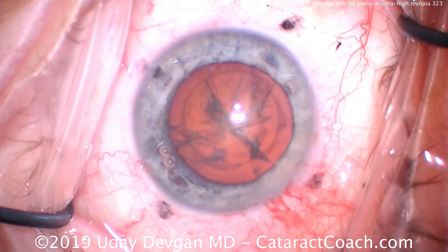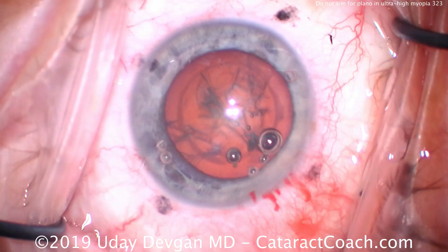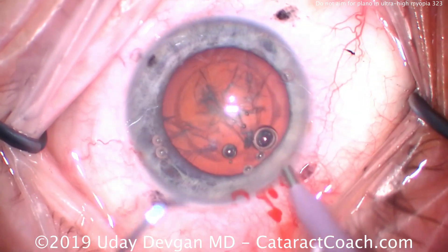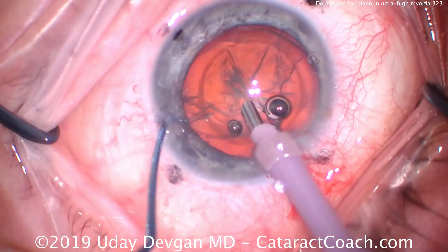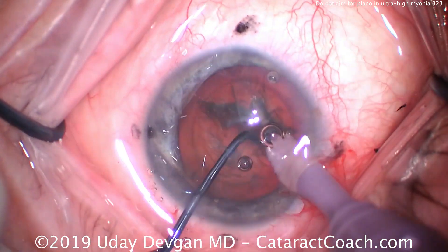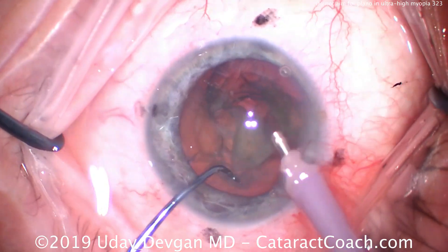The lens nucleus is hydrodissected then rotated. There's the rhexis — it looks very nice. A little extra viscoelastic to protect the central corneal endothelium. After hydrodissection, I'm adjusting the lid speculum to give my FACO Pro better access, with incisions at about 75 degrees steep meridian. Going inside the eye for the FACO chop — high vacuum, high flow. Chopping the nucleus in half, then bringing the halves up out of the capsular bag for easier emulsification.